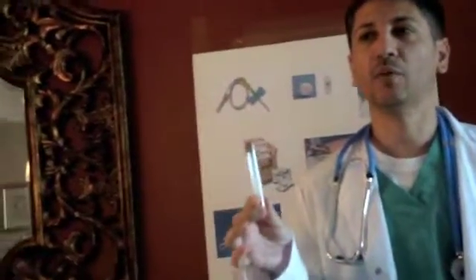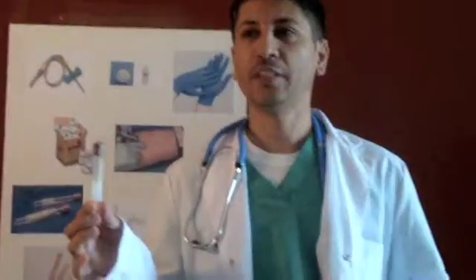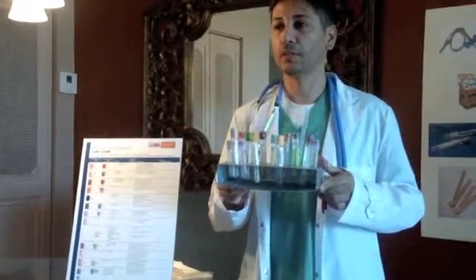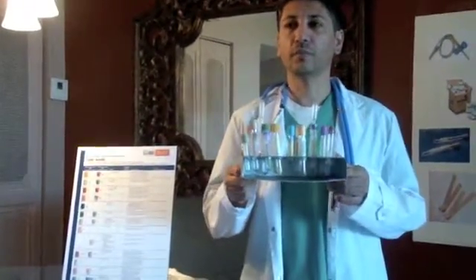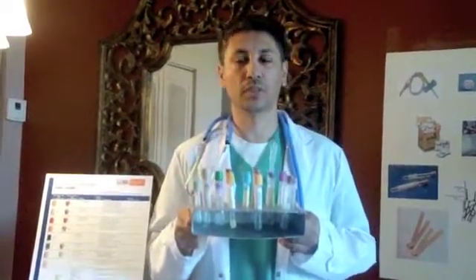The main idea came along with the purpose of helping to provide protection by reducing testing and treatment accidents as well. In today's market we have several types of manufactured syringes and test tubes. Open at the top, sometimes with a rounded U-shaped bottom, and some are large, designed especially for boiling fluids. These tubes are designed to draw a predetermined volume of blood. Some with different additives are used for collecting specimens for different types of tests.